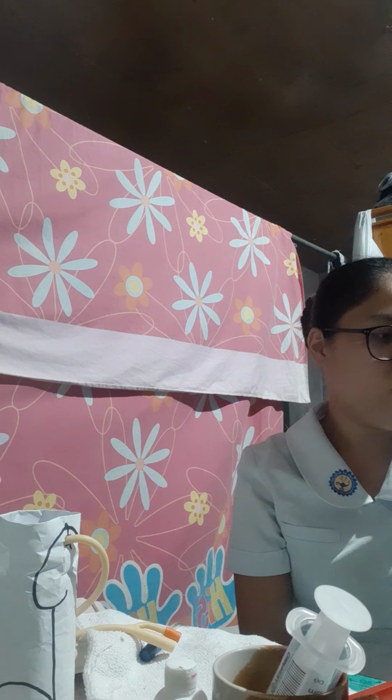Next, prepare equipment. So, perform hand hygiene.